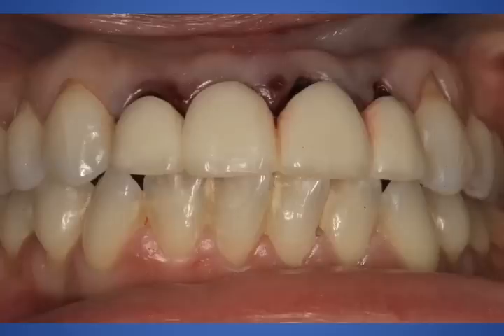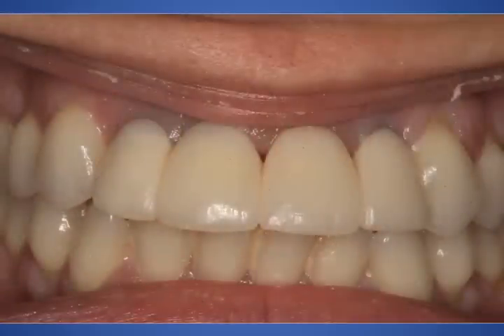And you can see the tissue is a little bit red, a little bit raw yet. But again, that was the day of. Here is 2 weeks after. You can see how the tissues are starting to contour a little bit.